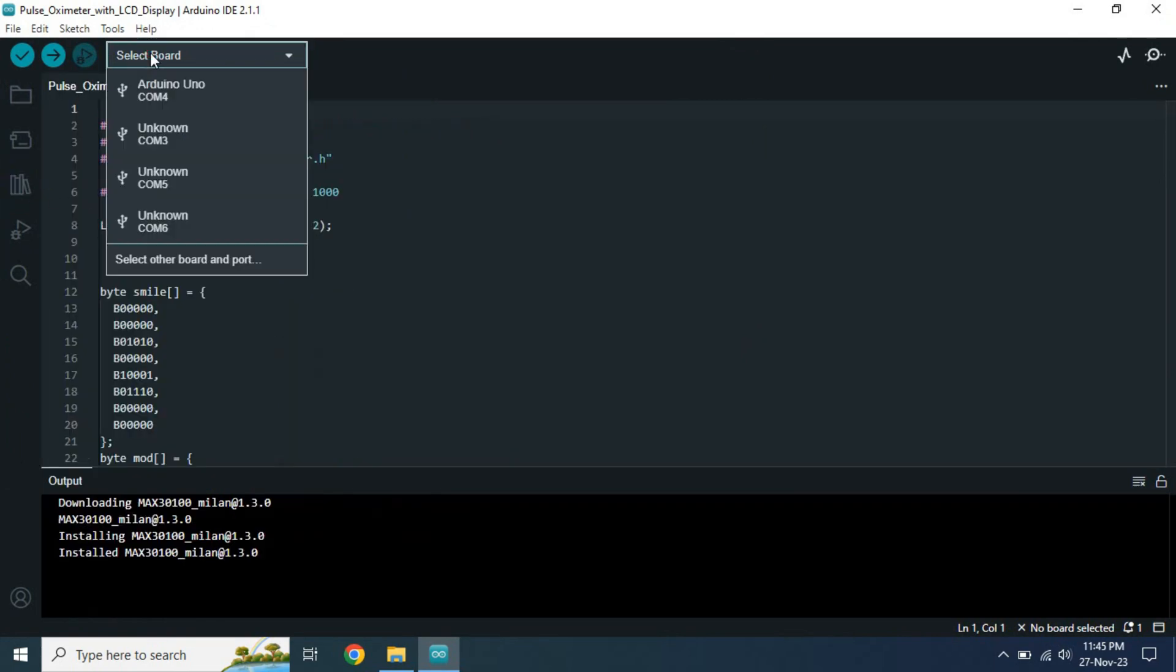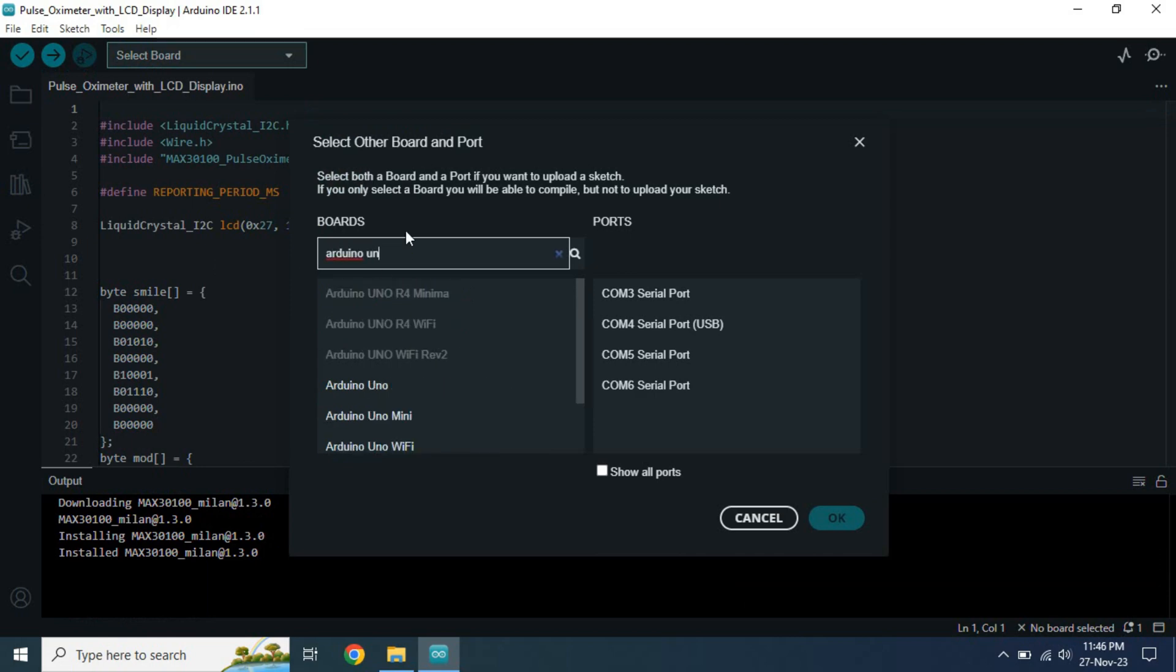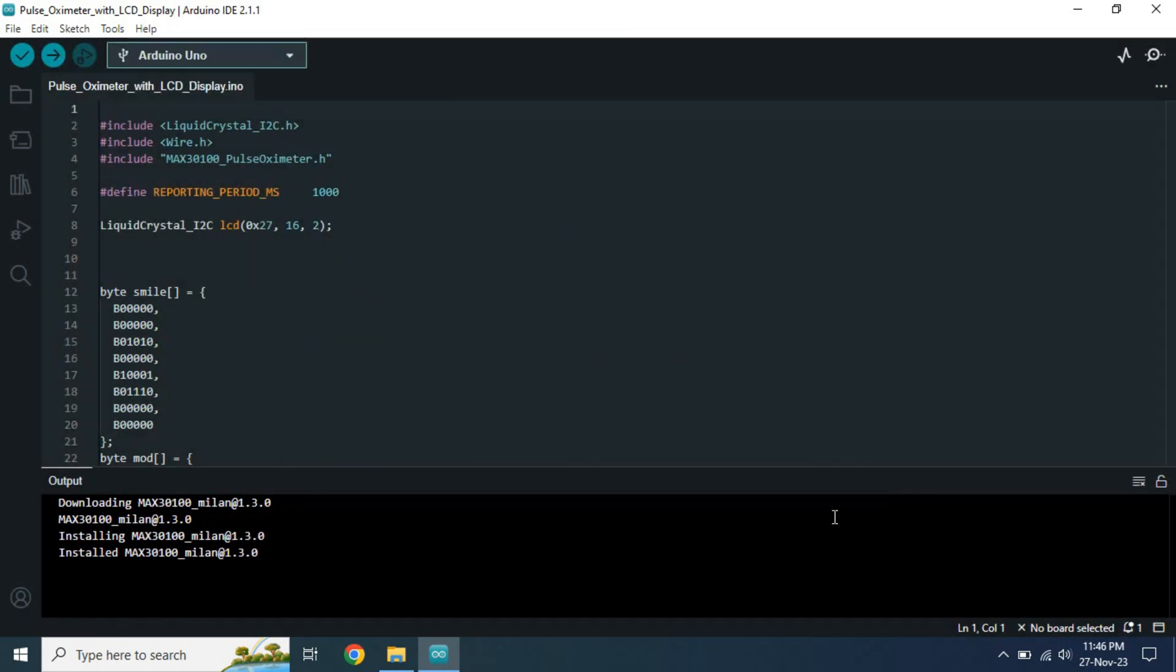Now select the correct board and port number. Then click on Upload button.